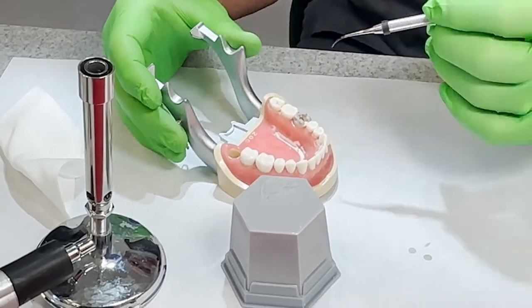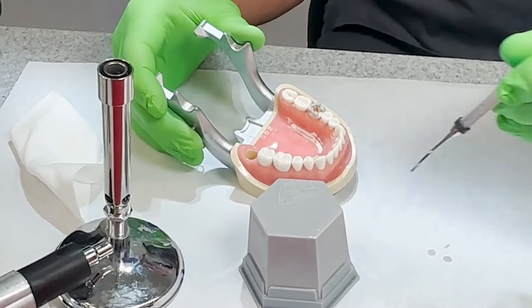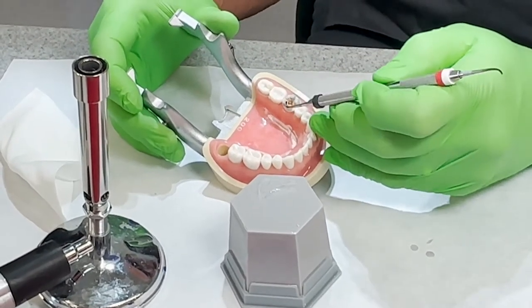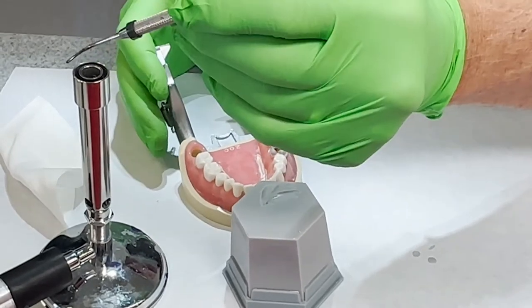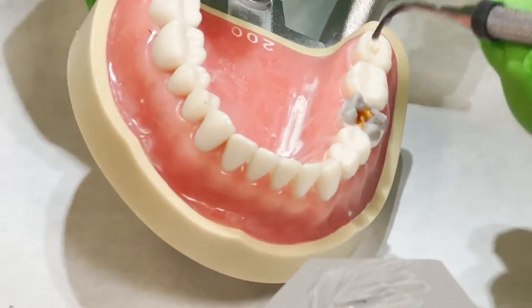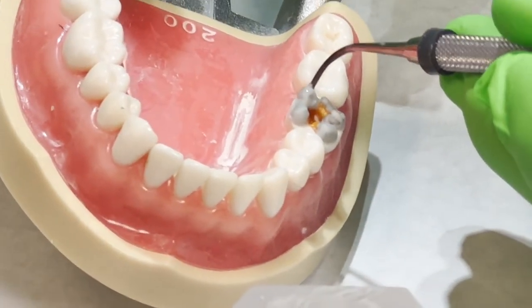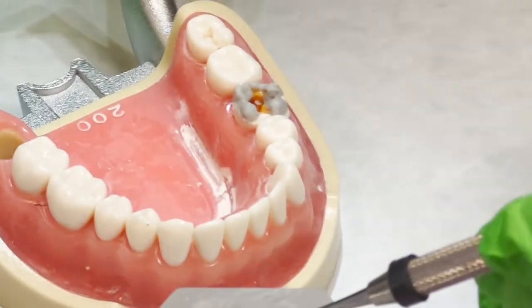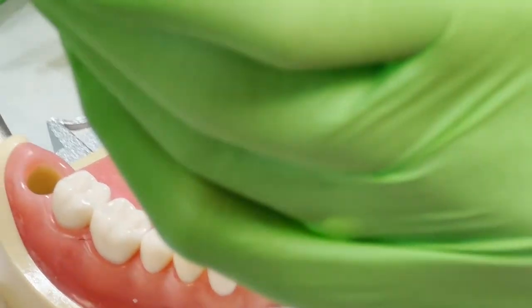Okay, so I just tried my occlusion and I can see the distal lingual cusp is hitting right here. So I got to be careful with that. You want to check that quite often. That way you don't get too high, because if you check it and it breaks, then you start over.